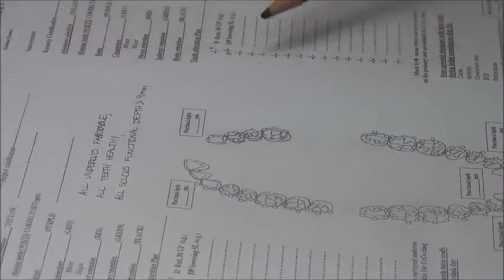When we have an empty form, for example, I'm giving you an exam and I have the empty form, meaning that there is nothing abnormal around. When we have abnormalities, we will show you in the later cases, we begin writing down the abnormalities. For example, we have fillings, we have mobility, we have a functional depth that is low. Later on, you will have high survey lines.